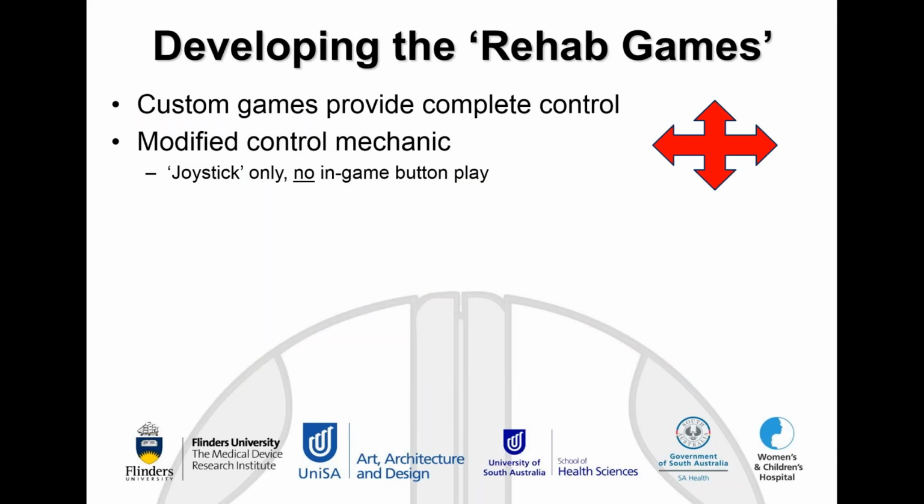So a bimanual device which removed the need for grip, fine motor control, didn't require buttons to play the games, and meant that they could effectively put their hands on the controller and just control their character in the game. On the other side of the fence, the other half of the project was developing what we call the rehab games for the project. We opted to design our own games from the ground up, and I'll explain why that was the case rather than trying to use commercial games.